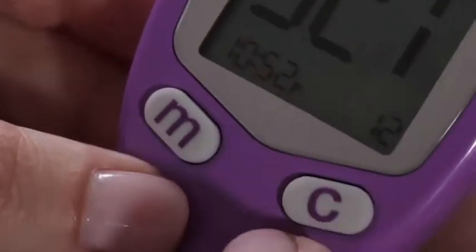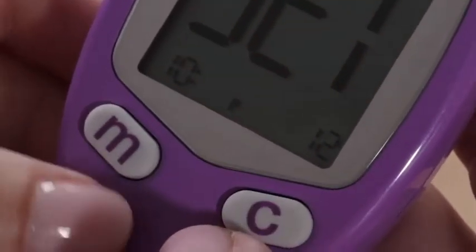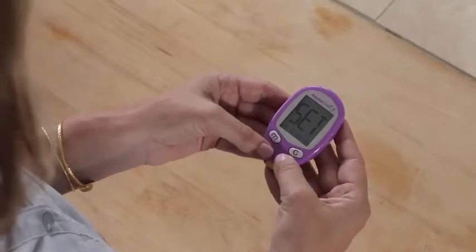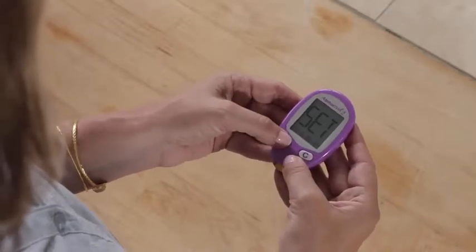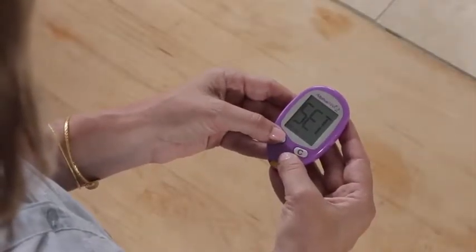You can set the time in either 12-hour or 24-hour formats. Press C to display the correct hour and M to save. To set the minutes, press C again to display the correct minute and then M to save. The date can be displayed in either month/day/year or day/month/year formats. Press C and display the correct month and M to save it. Press C again to select the day and M to save it. You can set the year the same way. Now, to save all your settings, press and hold down the M button for 3 seconds until the meter turns off.